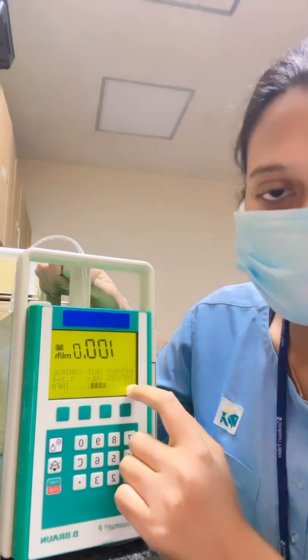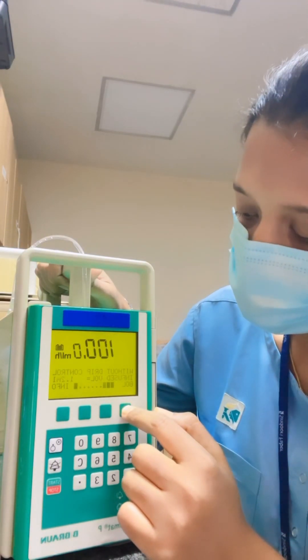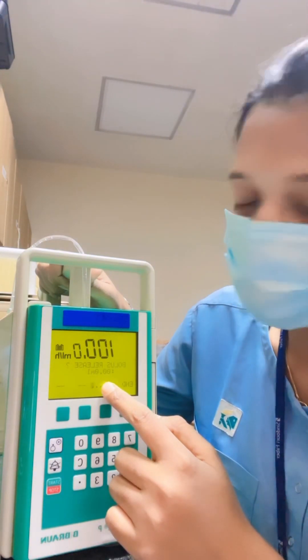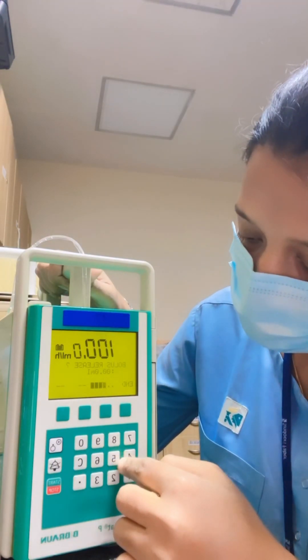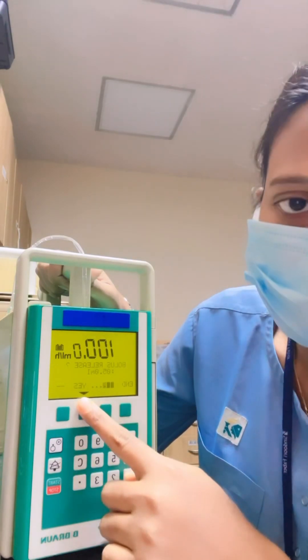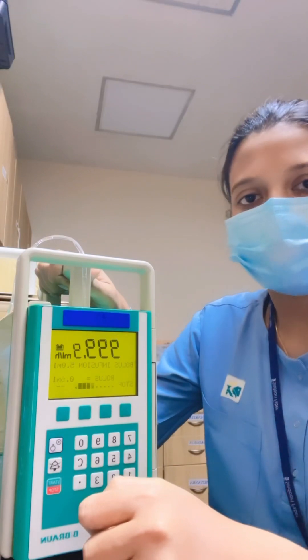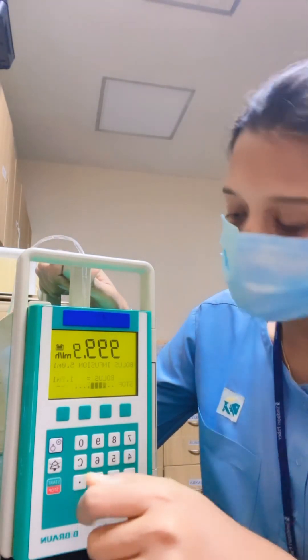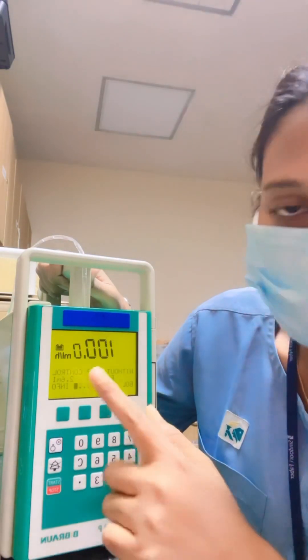For giving a bolus, 'bolus' is already shown on the display. Press the soft key just below 'bolus.' It will ask how much volume you want to give. For example, if I want to give 5 ml of bolus, simply press 5 and then yes. The bolus will start. If you want to stop the bolus in between, press stop and it will go back to the infusion.